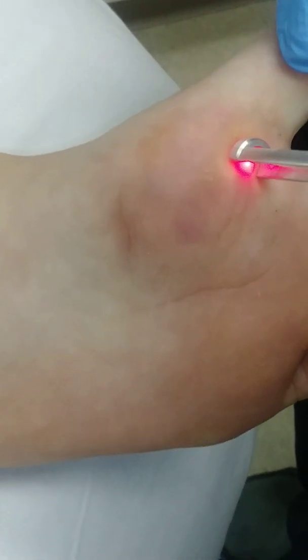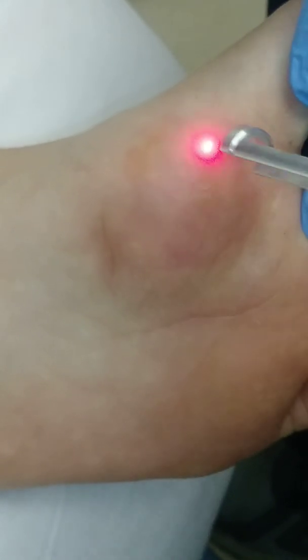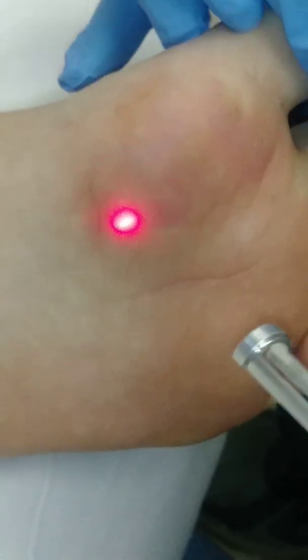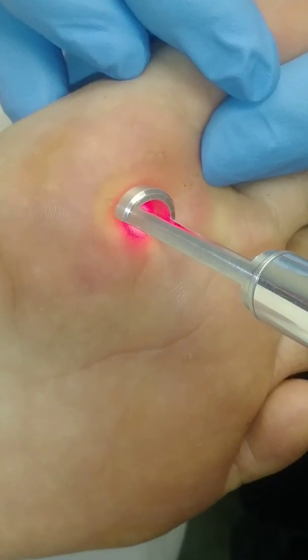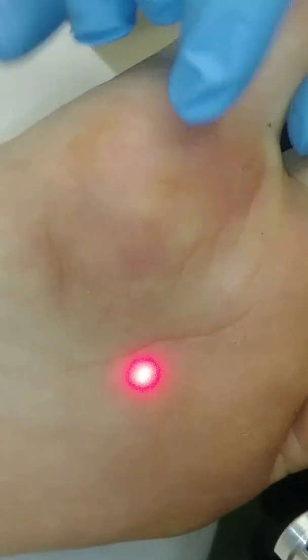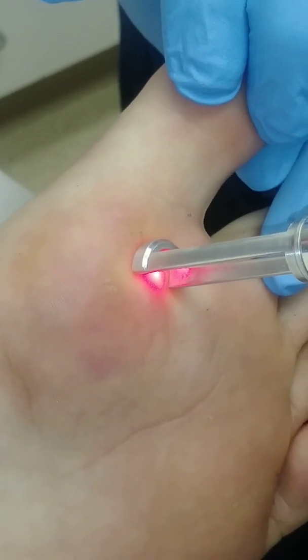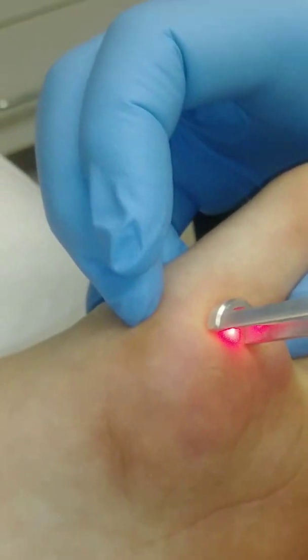We're about 80% of the way through these, keeping track of how many shots we're doing on each. Typically we'll do this about every two weeks until they're gone. This time we went three weeks and that did not negatively affect it. Sometimes if you go three or four weeks or longer, it's like you're starting all over again brand new, but hers improved so much on that last treatment that I think we can go at least three weeks again.